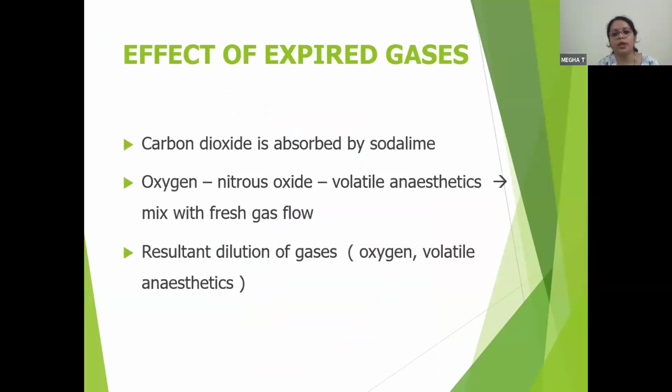So what happens to the expired gases? I have told this: carbon dioxide is absorbed by the soda lime, whereas oxygen, nitrous oxide, and volatile anesthetics are not absorbed and will mix with the fresh gas flow. Hence, a resultant dilution of gases occurs, oxygen and volatile anesthetic.